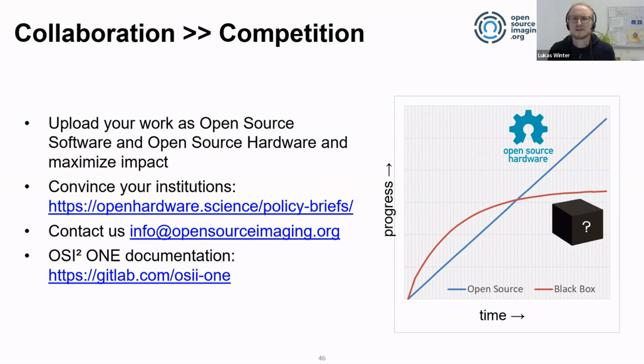And in general, I do think that because the Red Pitaya is not designed for MR application, if you have something more customized, of course you would also need the community behind it to drive that. If not, then it's probably better to have something proprietary that works and that you know will have a next product or some support, than going for an open source design that has no community and then dies off in a few years.